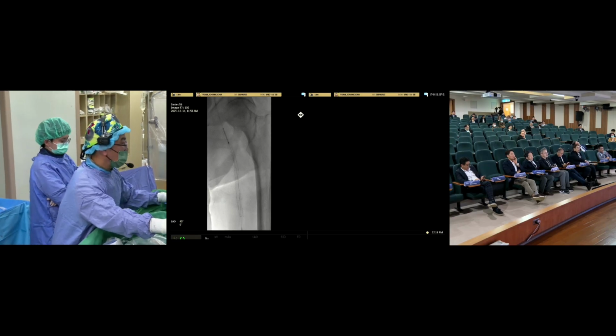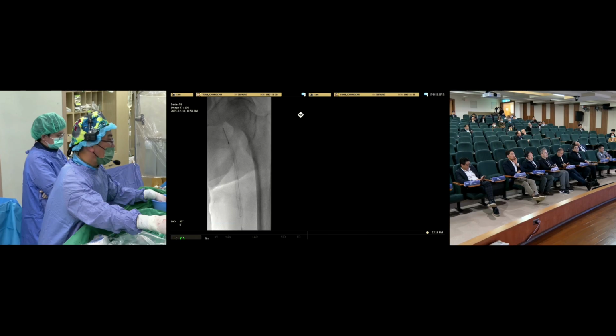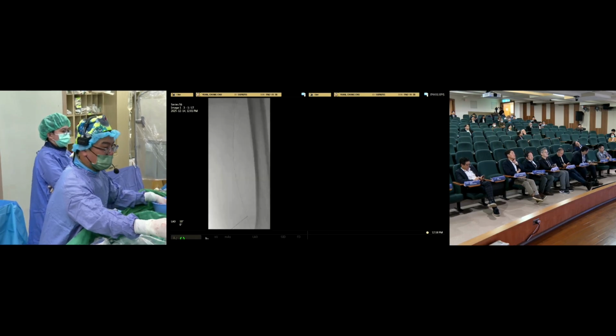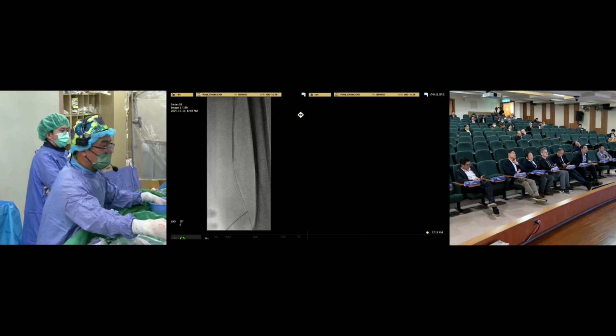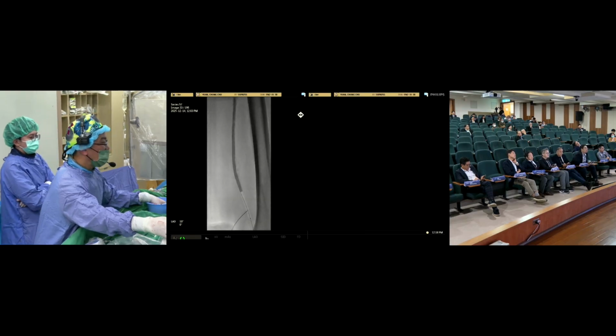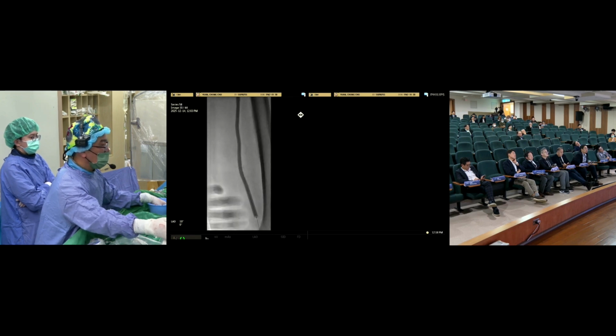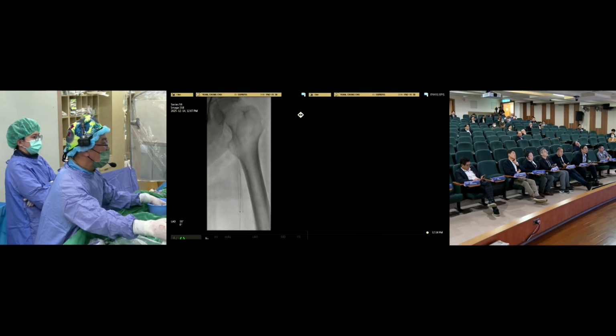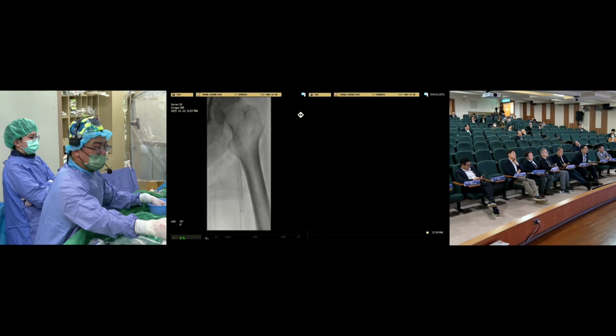We put a stent in the proximal SFA, an Eluvia 7 by 150, and landed the DCB in the distal SFA to T1, and performed the hemostasis. And we landed a 6 high-pressure balloon later.